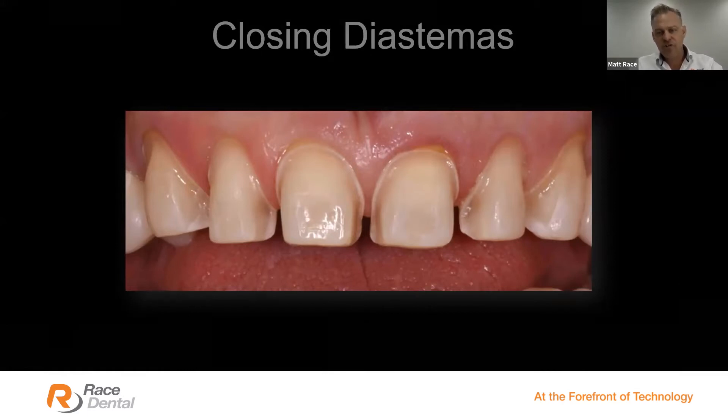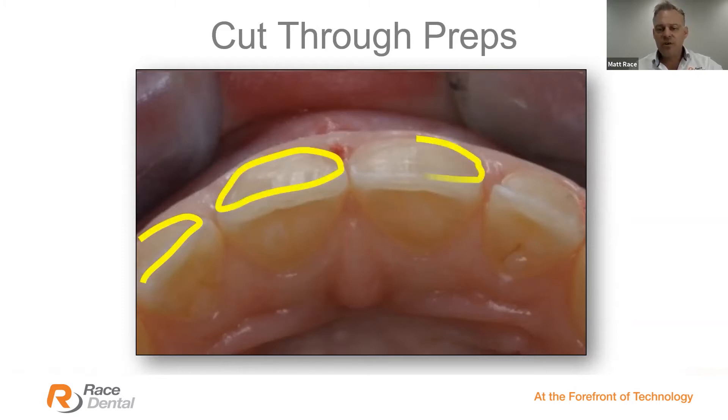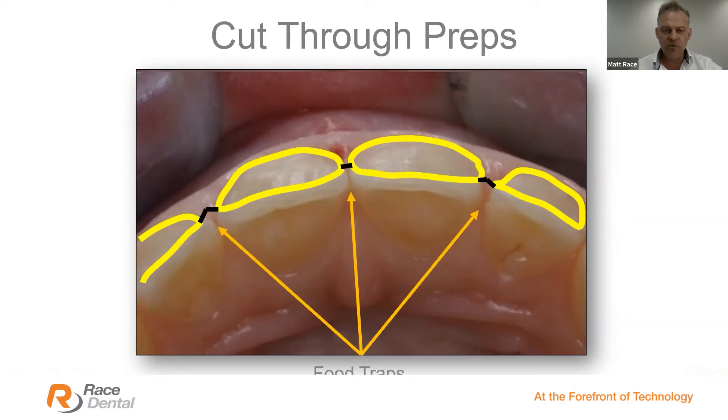Here are some beautiful preparations — a fantastic piece of craftsmanship — but unfortunately not what we need technically to close those black triangles and diastemas efficiently. It saddens me to see this much craft go in, with beautiful margins and everything required, except the science needed to close those gaps. Looking from the occlusal view at veneer preparations, you can see the challenge we face as technicians — those highlighted margins in yellow show where the preps create chronic food traps in the palatal regions.